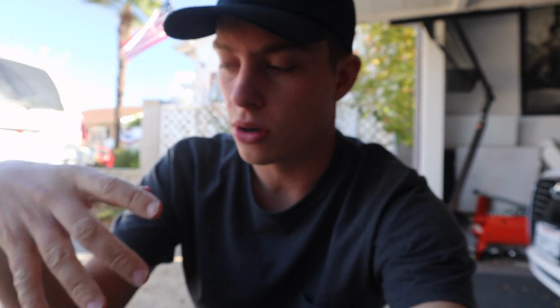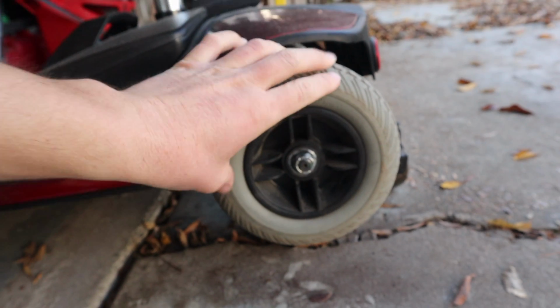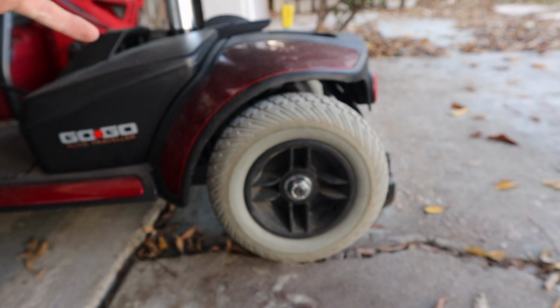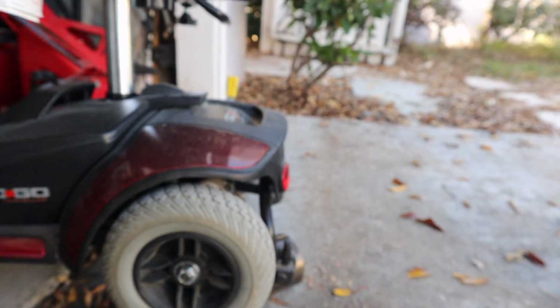Okay, now that we're back from Home Depot with the hardware that we need, which I'll explain a little bit later, to start this go-kart wheel swap on a wheelchair, you're gonna want to first take off your stock wheel. For me, it takes a 3/4 bolt, and then once that's off, I have a washer, and then the wheel comes right off.